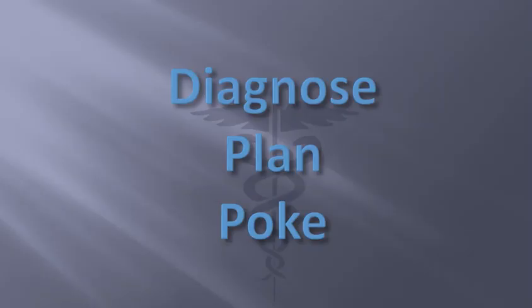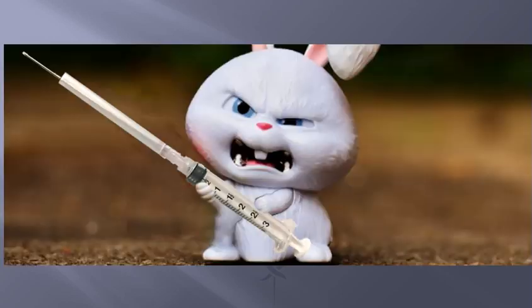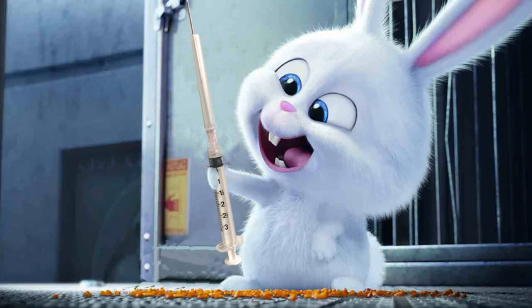So overall, just 3 steps. Take a look, see if they have an abscess. Maybe they just have a cellulitis and you can skip the whole thing. But if they do have an abscess, you can plan on where you need to go, how deep you need to go, where the artery is, and then you can either use the ultrasound for real-time guidance or not. But overall, my attitude about taking care of these patients has changed drastically. And while I used to dread them, I think they're kind of fun, and I do think this is a pretty useful technique.